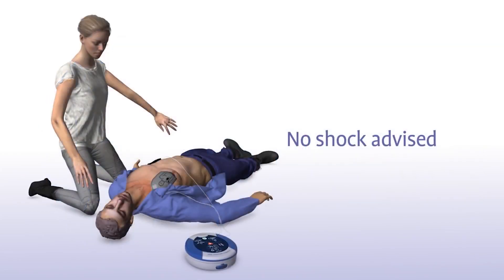Sometimes no shock is needed in a life-saving situation, and the Samaritan PAD will tell you in that instance. No shock advised.